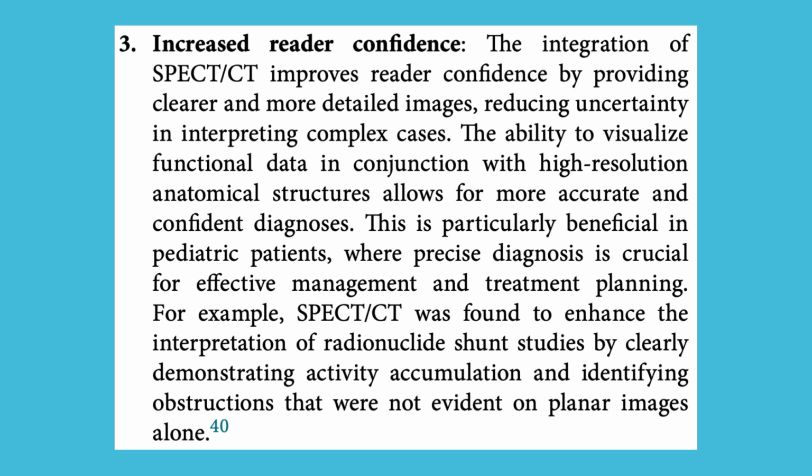For example, SPECT/CT was found to enhance the interpretation of radionuclide shunt studies by clearly demonstrating activity accumulation and identifying obstructions that were not evident on planar images alone.